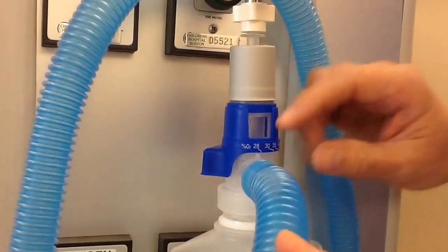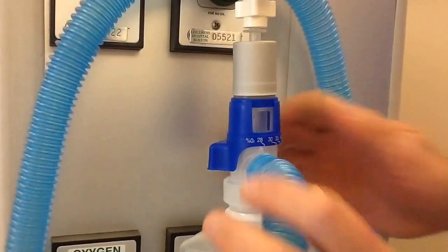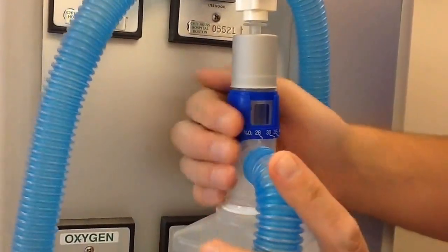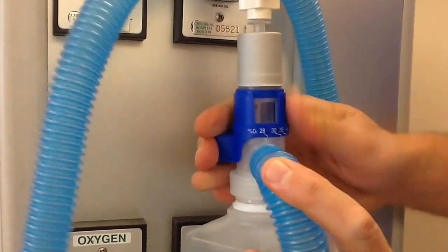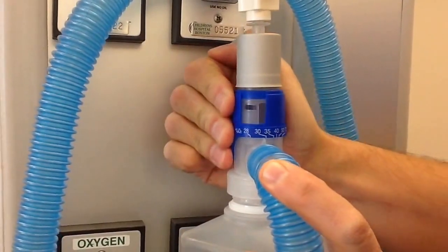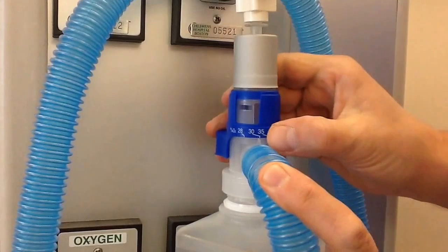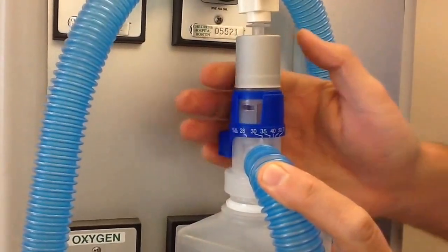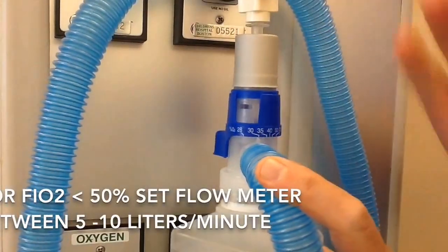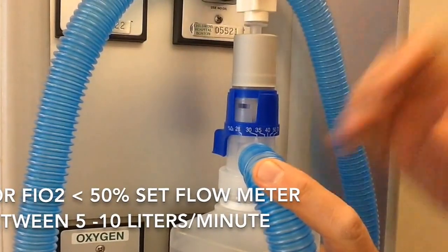Alright, this is a close-up of the other device that we have. And as you can see, this little blue dial has percentage of oxygen right on it. Now this little knob kind of sticks out where my finger is, and we could actually turn this little blue dial and dial in the precise FiO2 that we want to have delivered to the patient. So right now we're approximately at 35%, and as we discussed earlier, for any FiO2s less than 50%, we need approximately 5 to 10 liters per minute from the flow meter.